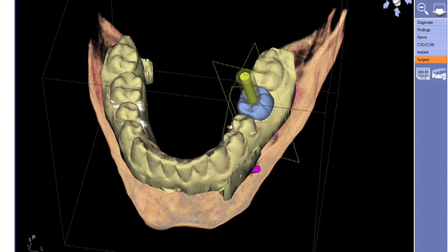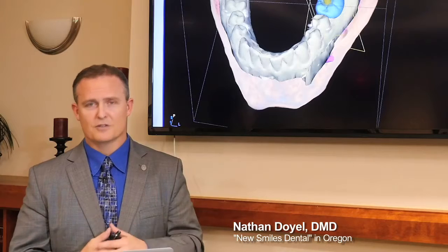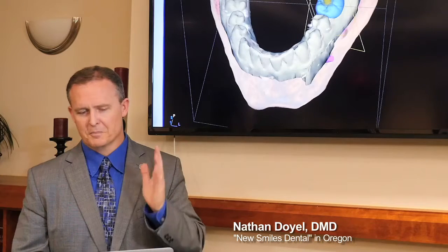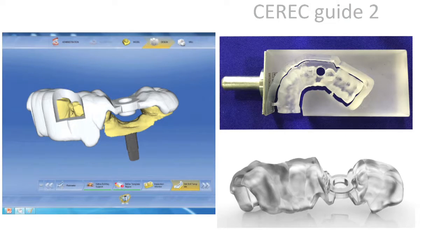So we get this overlapping of the CBCT and the digital scan, and you get the ability to place the implant exactly where you want it to come out of the center of the crown. And you can put it parallel to adjacent teeth and screw retain it. That allows us to create our own guide. We do a lot of guided implant surgeries here, and this is what it looks like for us.